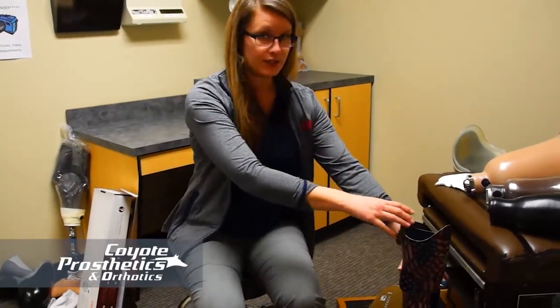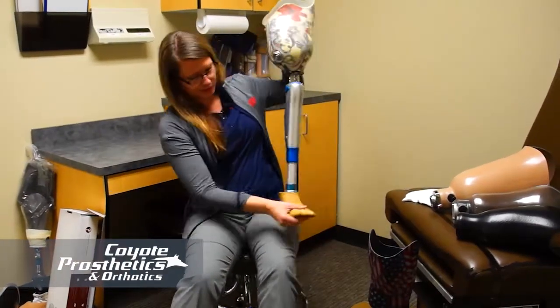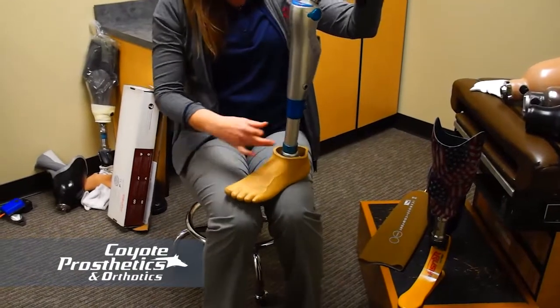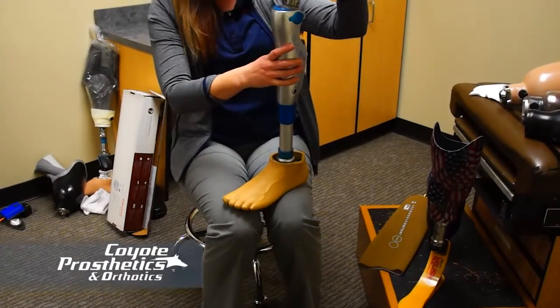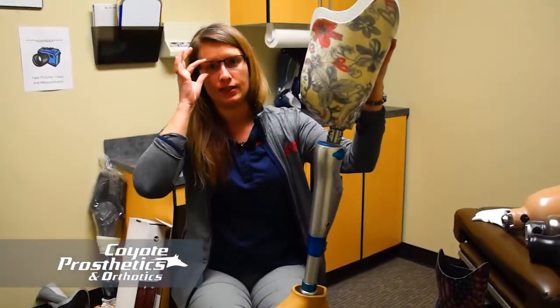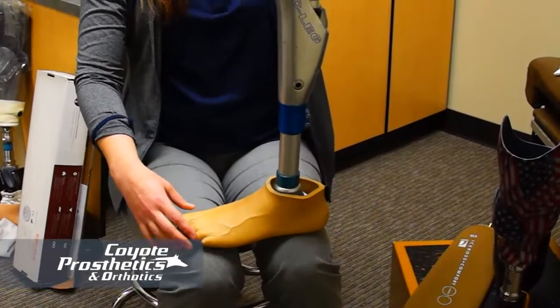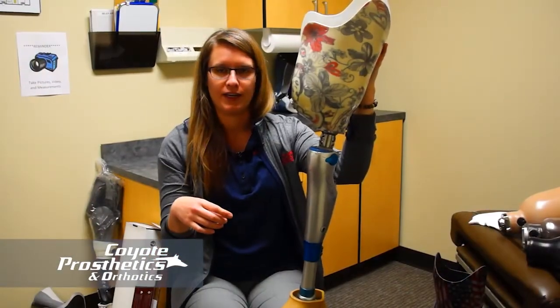And then you'll have a foot shell over top of it. So this is an example of that. So the foot part is actually inside of the foot shell. And one thing you need to be really careful with as an amputee is that you don't switch your shoes to a different heel height. You can switch your shoes, but make sure that they're the same heel height.